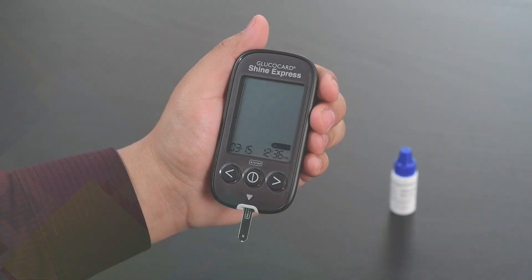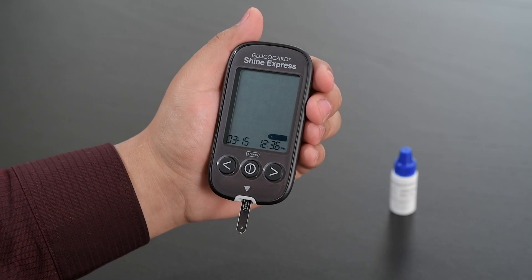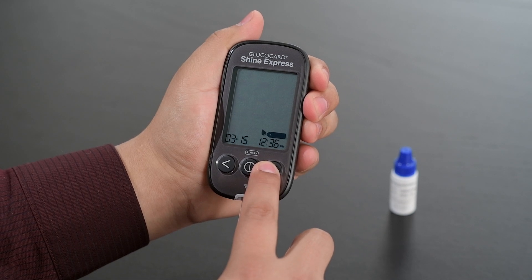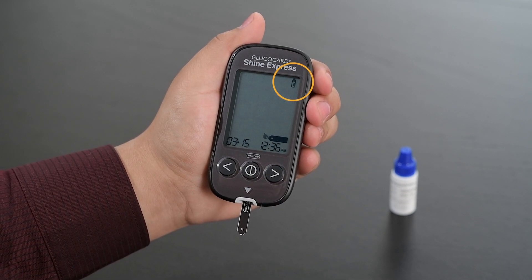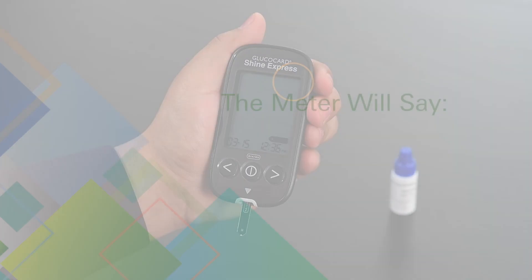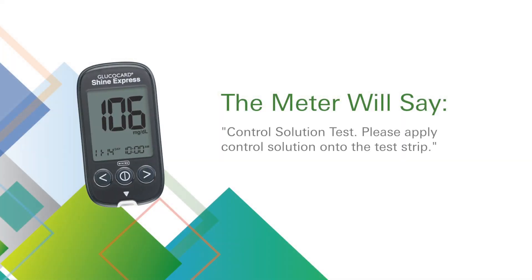To enter the control solution test mode, press and hold the right arrow button for three seconds until the control solution test symbol appears on the display. The meter will say: control solution test, please apply control solution onto the test strip.